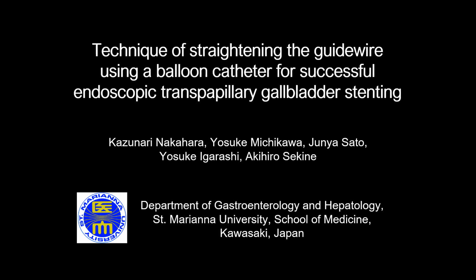Technique of straightening the guide wire using a balloon catheter for successful endoscopic transpapillary gallbladder stenting.